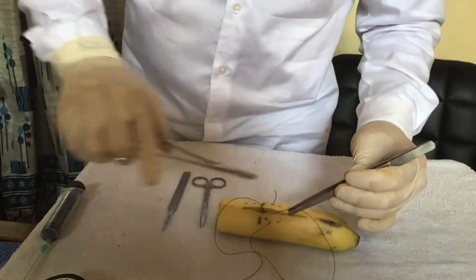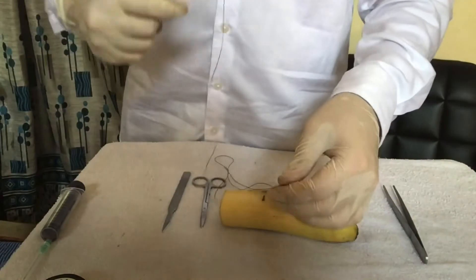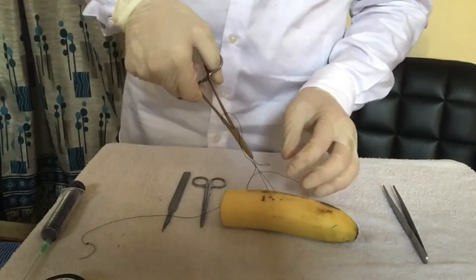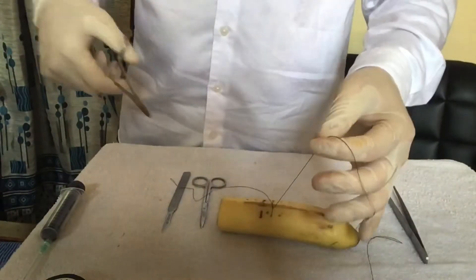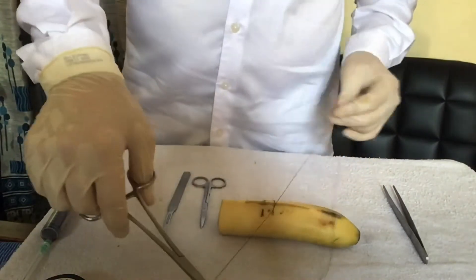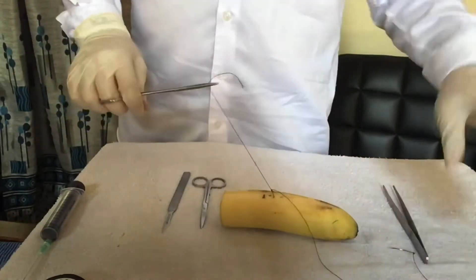Take help of forceps but don't hold the needle from the tip. Now to tie a knot, wrap the thread around the needle holder and pull the short end of the thread towards you and then away from you. Repeat this alternately multiple times to make sure the knot won't untie.